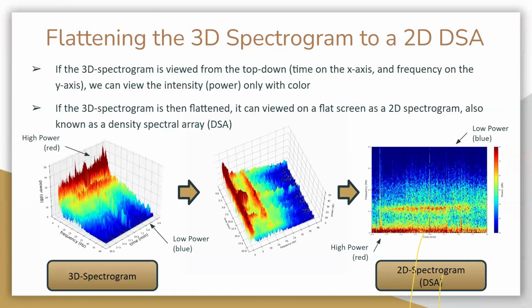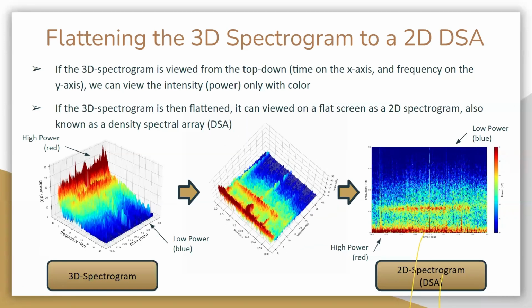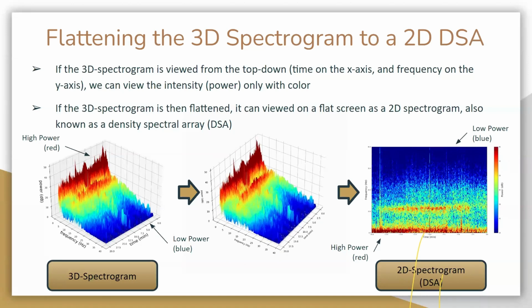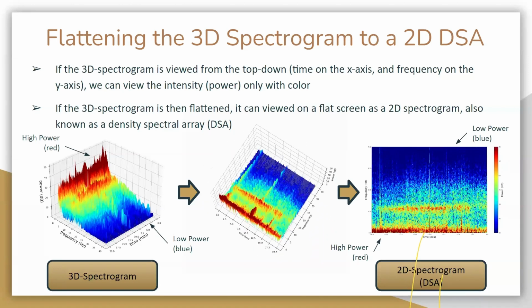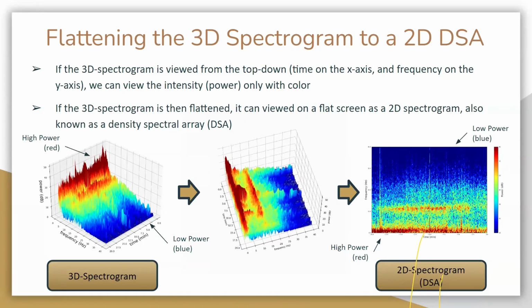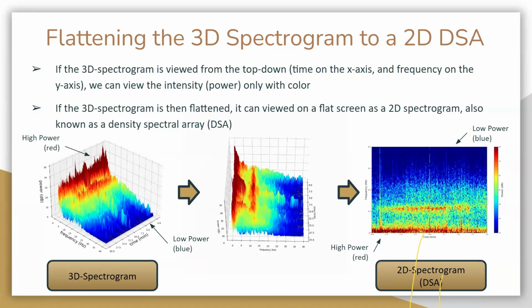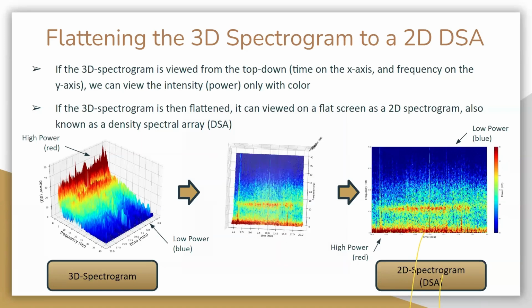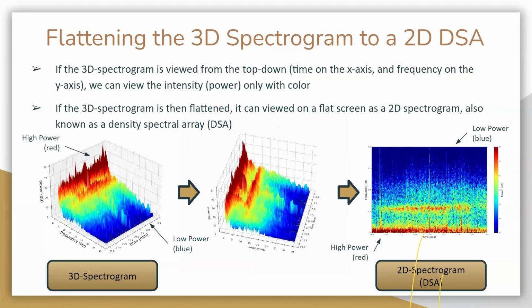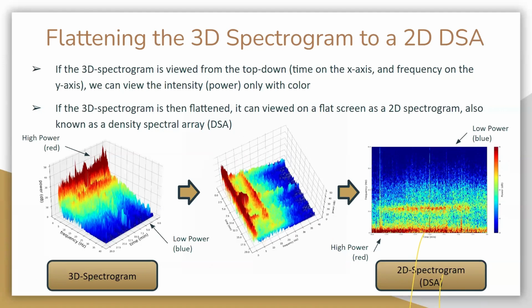if you play with the scale of the decibels? For example, not infrequently I come into rooms and the scale has been messed with and there is a solid red band from alpha on down to delta. It's just red, like that sign B you saw. And obviously that's probably not the case. So how do you determine, because every patient, depending on their brain power, is going to be different. You have a young person versus an older person. How do you determine visually what the right scale would be for a patient? That's a difficult question.